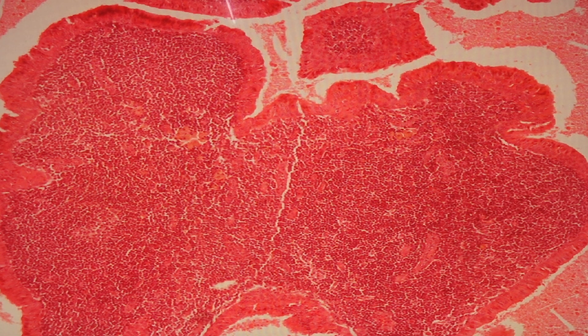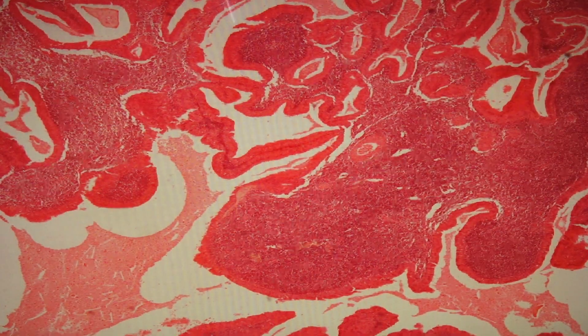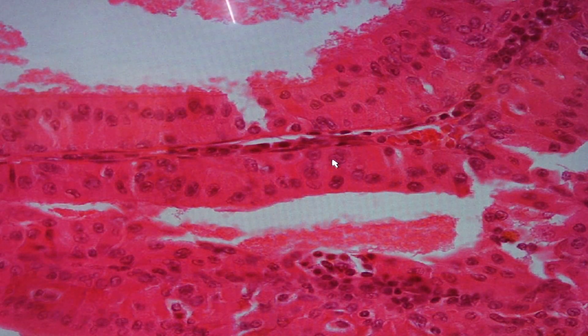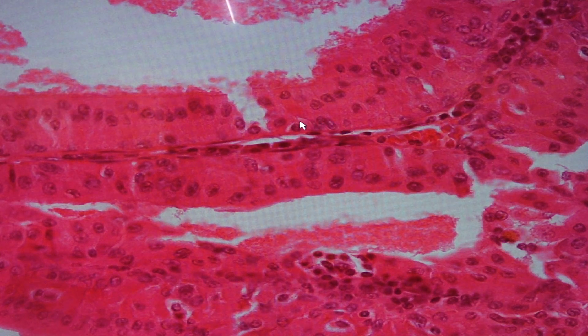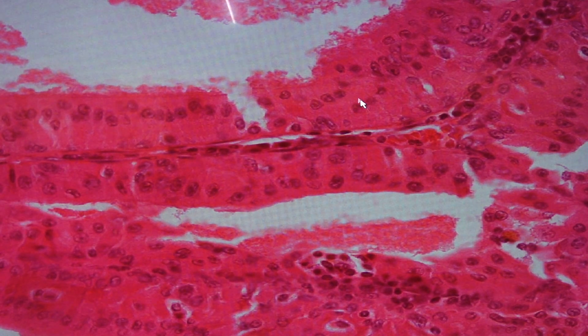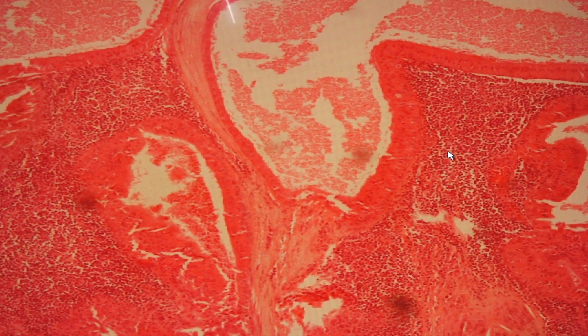Warthin's tumor is associated with smokers and males, and is seen in the 50 to 70 year old bracket. Histologically at the scanning view, you can see a lot of cystic spaces. These cystic spaces are lined by a unique double-layer epithelium: the lower portion is cuboidal and the upper portion is columnar. Take note of their granular cytoplasm — these cells are oncocytes — and the stroma is composed of lymphocytes.